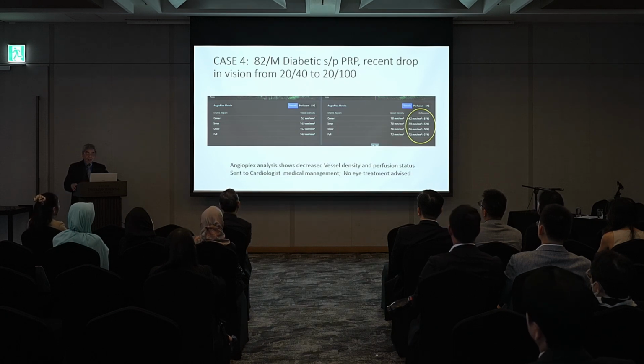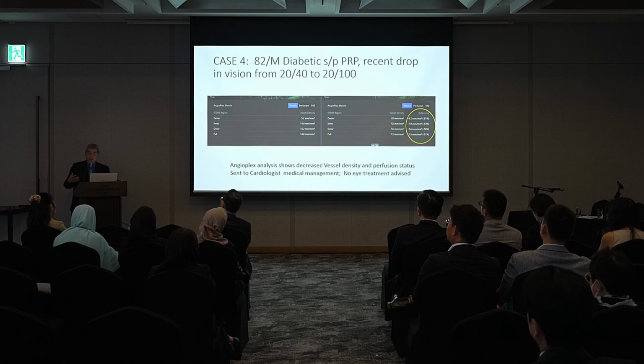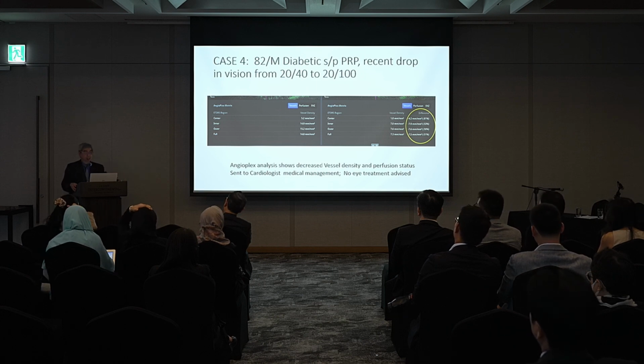And in this case, we're not sure what this patient has, so we looked at the angiography analysis of the Retina Workplace, and we actually saw that compared to a previous scan, there was a decrease in the perfusion of this patient. We were explaining to the patient that maybe he had some further occlusion of the perifoveal blood vessels that caused him to lose some vision.